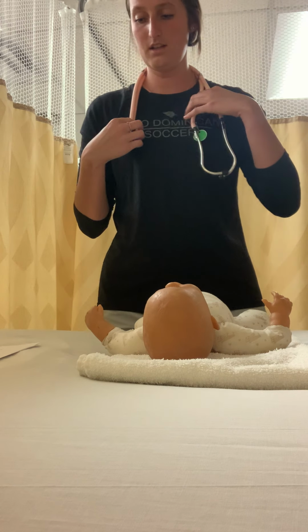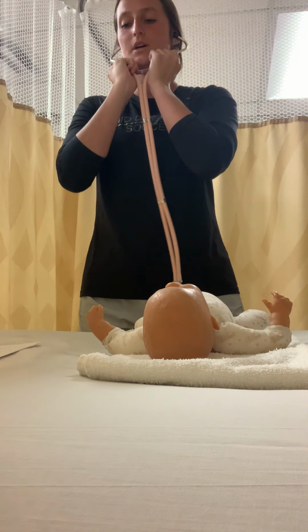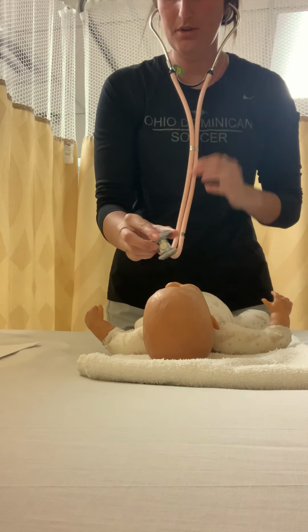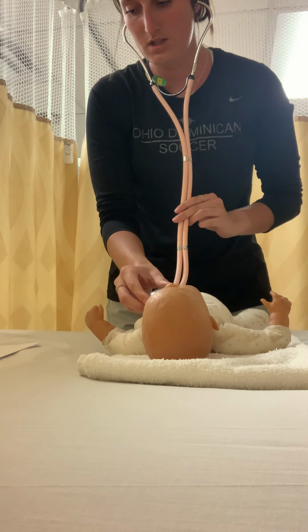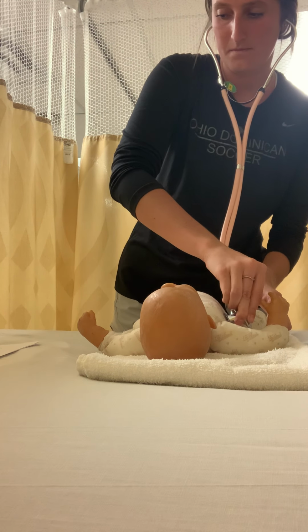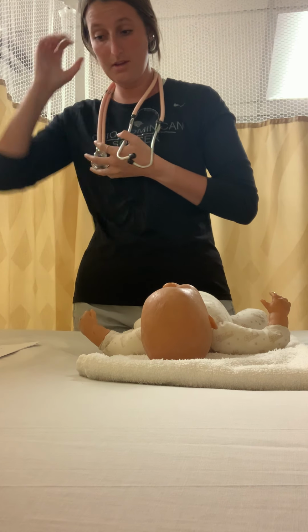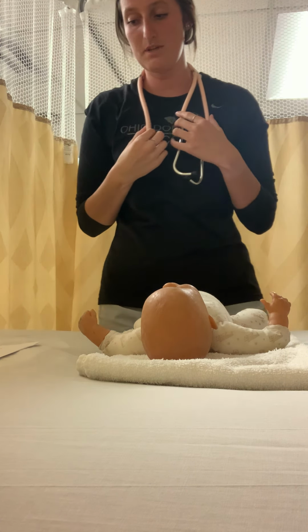I would then listen to breath sounds, warming up the stethoscope. I would start in the upper lobe areas and go under the arms, and I would compare each side. And the stethoscope is placed on lateral portions of the chest for the best contact. Air exchange should be equal on each side, and I would be listening for any abnormal breath sounds, like crackles.